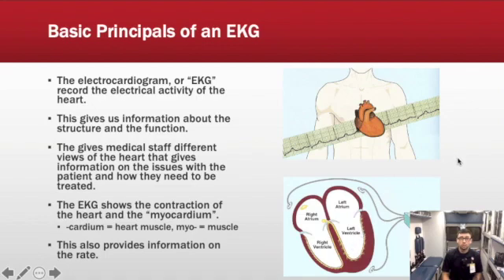So, the basic principles of an EKG. As we tell people, we're taking a picture of their heart. We're not actually taking a picture of their heart; we're recognizing the electrophysiology that is actually making the EKG.